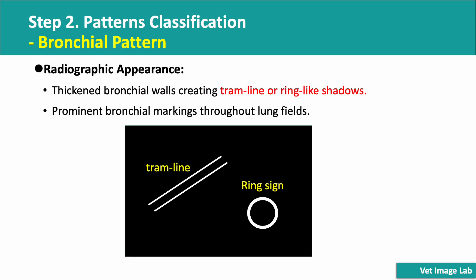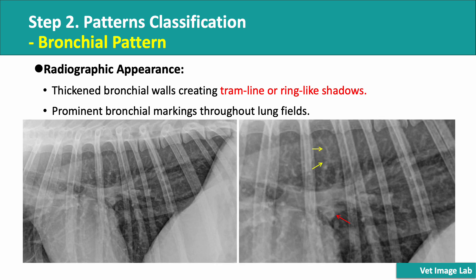Let's take a look at bronchial patterns and how they appear on radiographs. In this pattern, we see thickened bronchial walls, which form distinct tramline or ring-like shadows on X-rays. These changes occur when the bronchial walls become inflamed, accumulate mucus, or undergo mineralization over time. One of the key characteristics of the bronchial pattern is the prominent visibility of bronchial markings throughout the lung fields. These changes indicate bronchial disease, where inflammation or mucus accumulation causes the bronchi to become more prominent on X-rays.